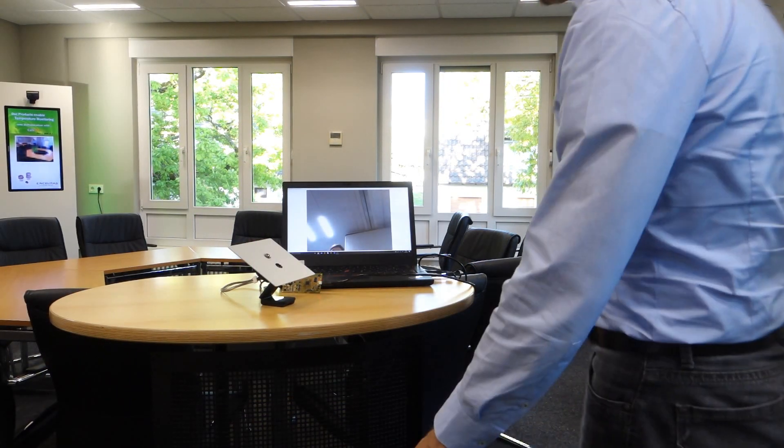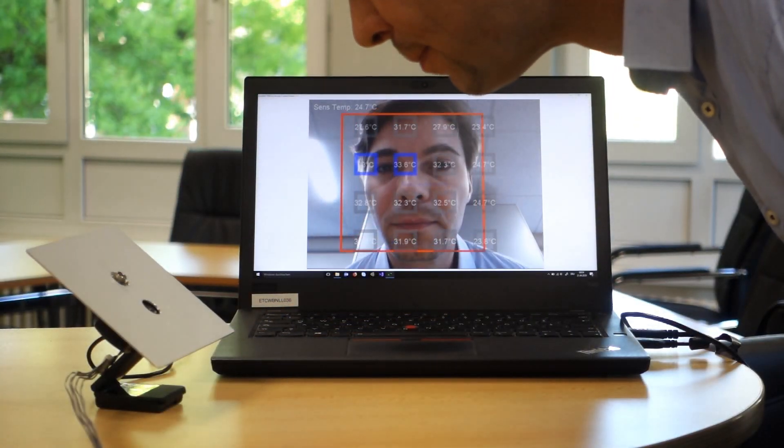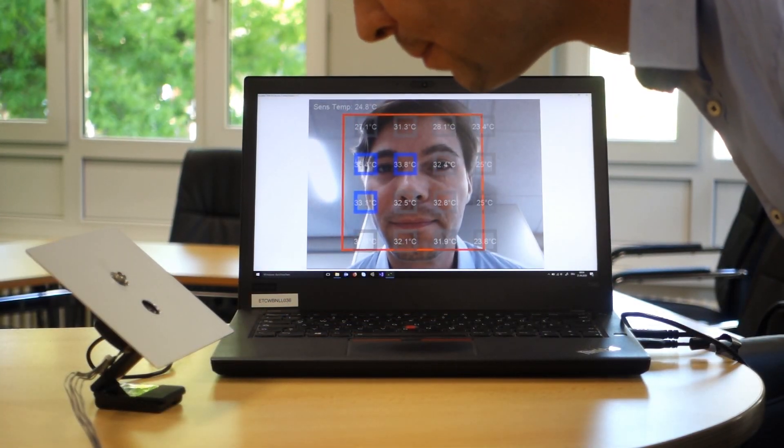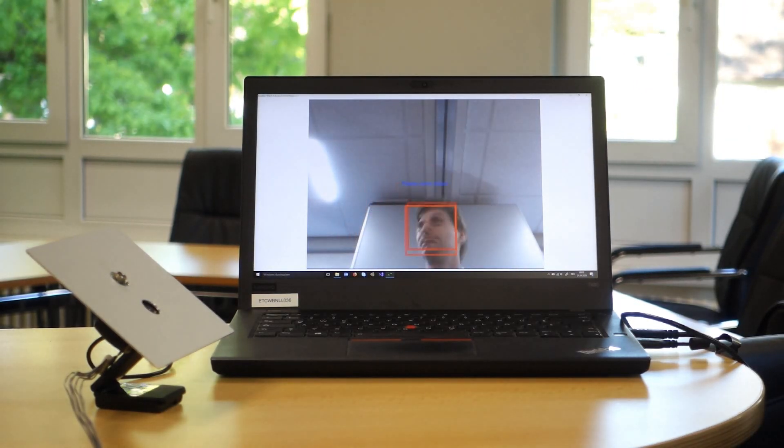In this demonstration we wanted good and well-controlled face coverage. A face tracking software allows guiding the person to a good alignment with the sensor. The warmest measurement should be used in the following data analysis.